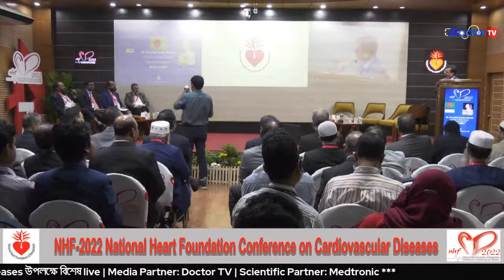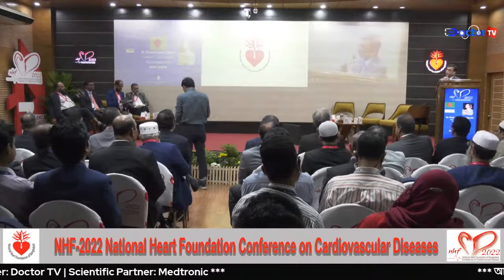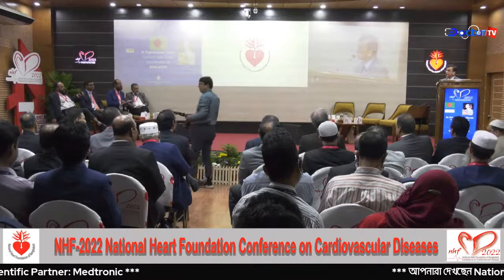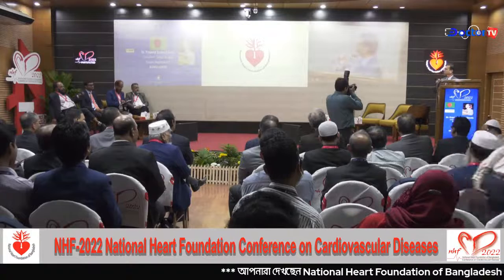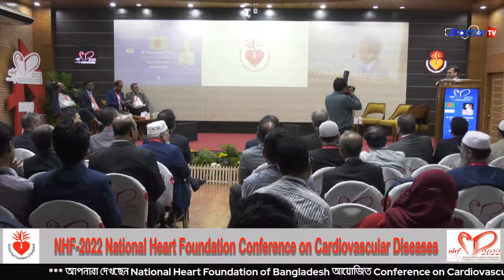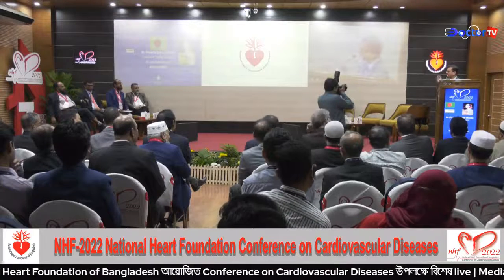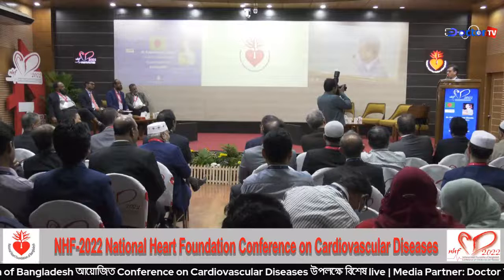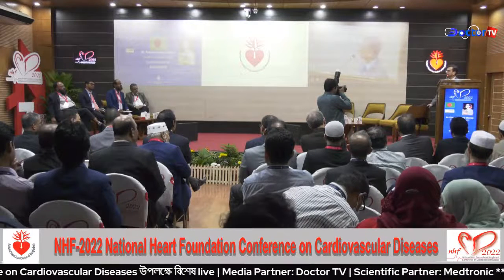What CPB? Femoral? Yes, sir. We actually prepared the femoral, and for the initial few cases, we even opened and took the first purse-string, ready for CPB in 2 to 3 minutes. But from time to time, we are not now opening our groin, but we prepare the groin for CPB establishment through the femoral.